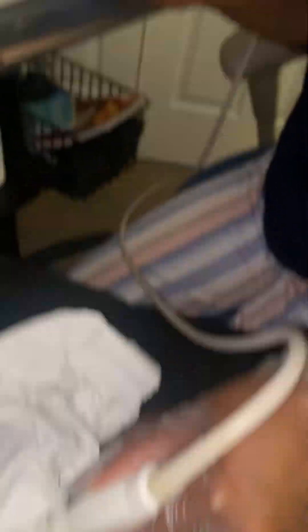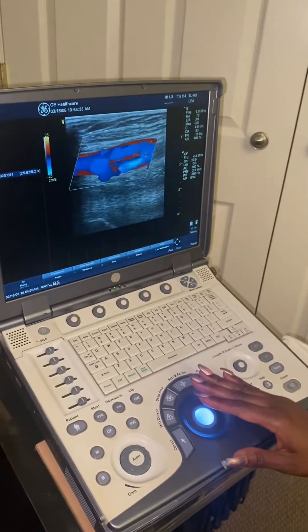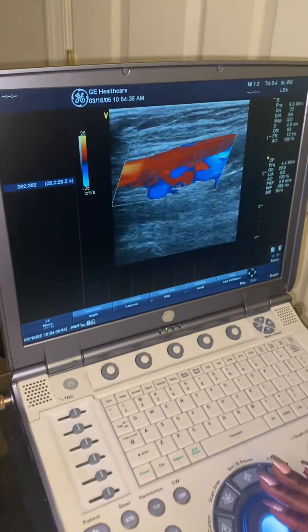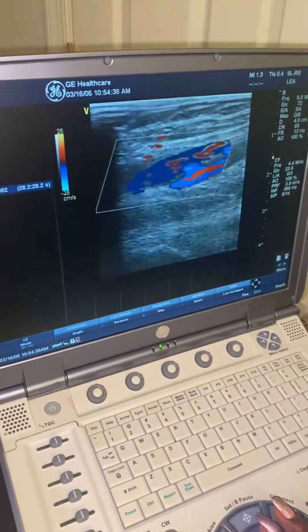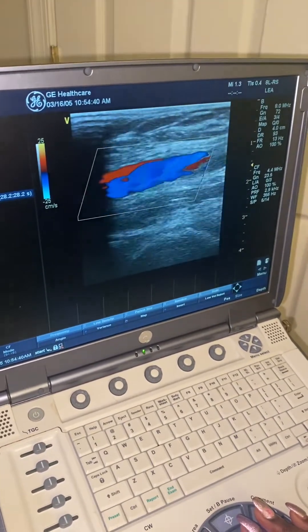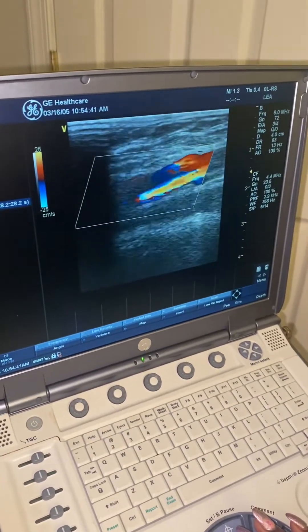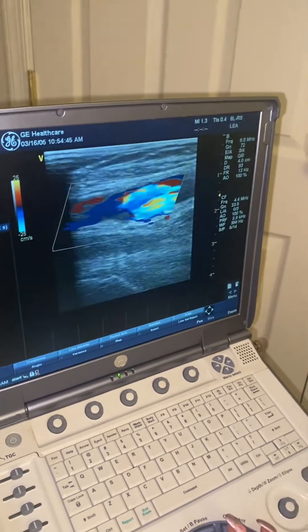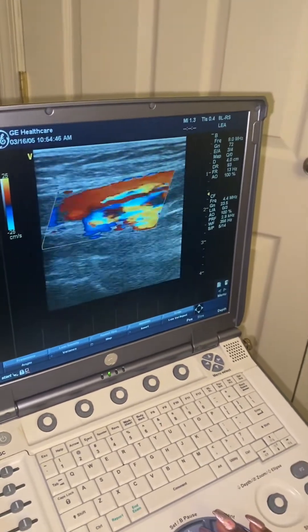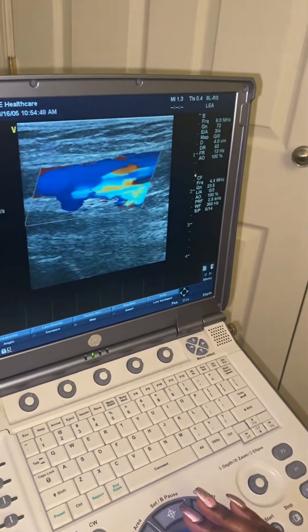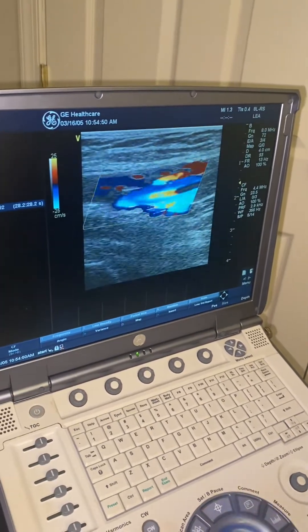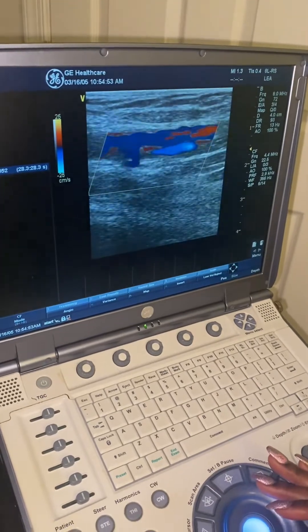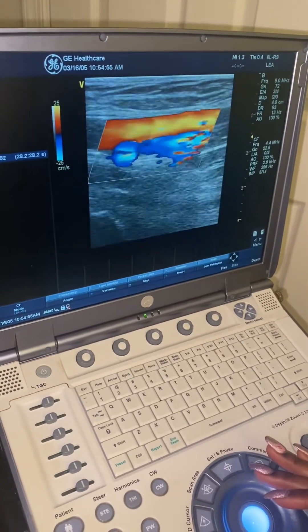In this image, what I'm doing is literally just rocking my probe — I'm really not moving at all. You can see me just rocking, rocking, rocking up towards this patient's head, and now I'm rocking back down to the common femoral artery. Now I'm at the superficial femoral artery. I'm going to squeeze the vein out of the way — that's my superficial femoral artery.